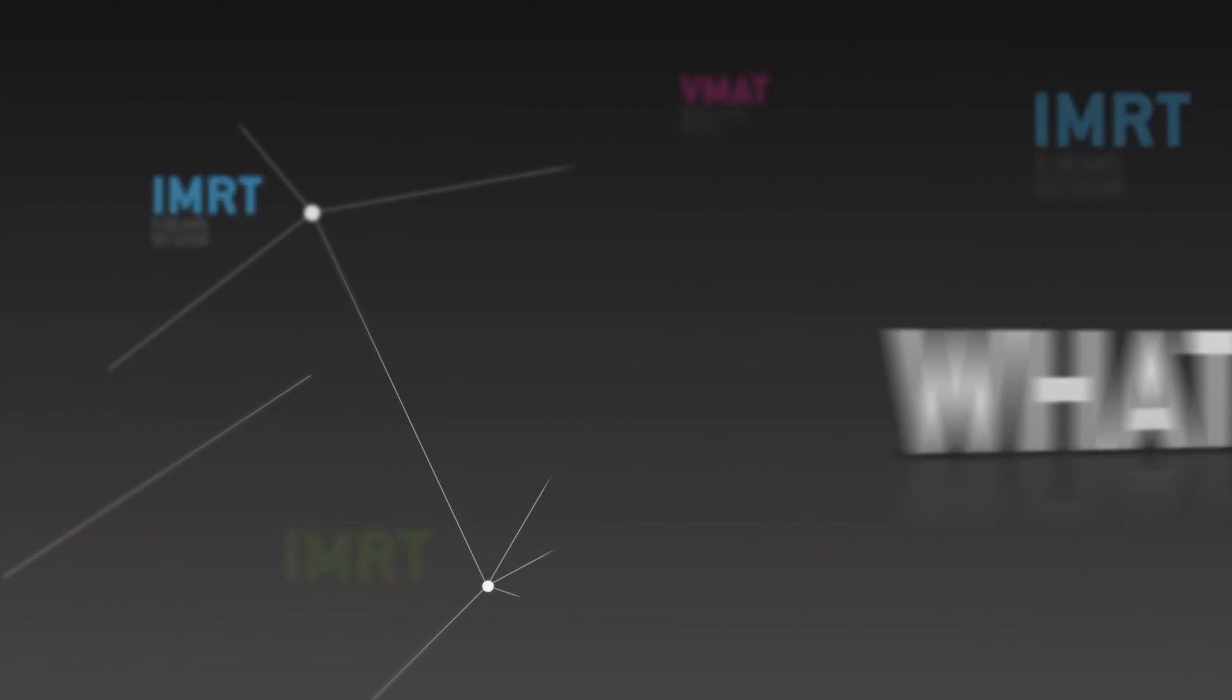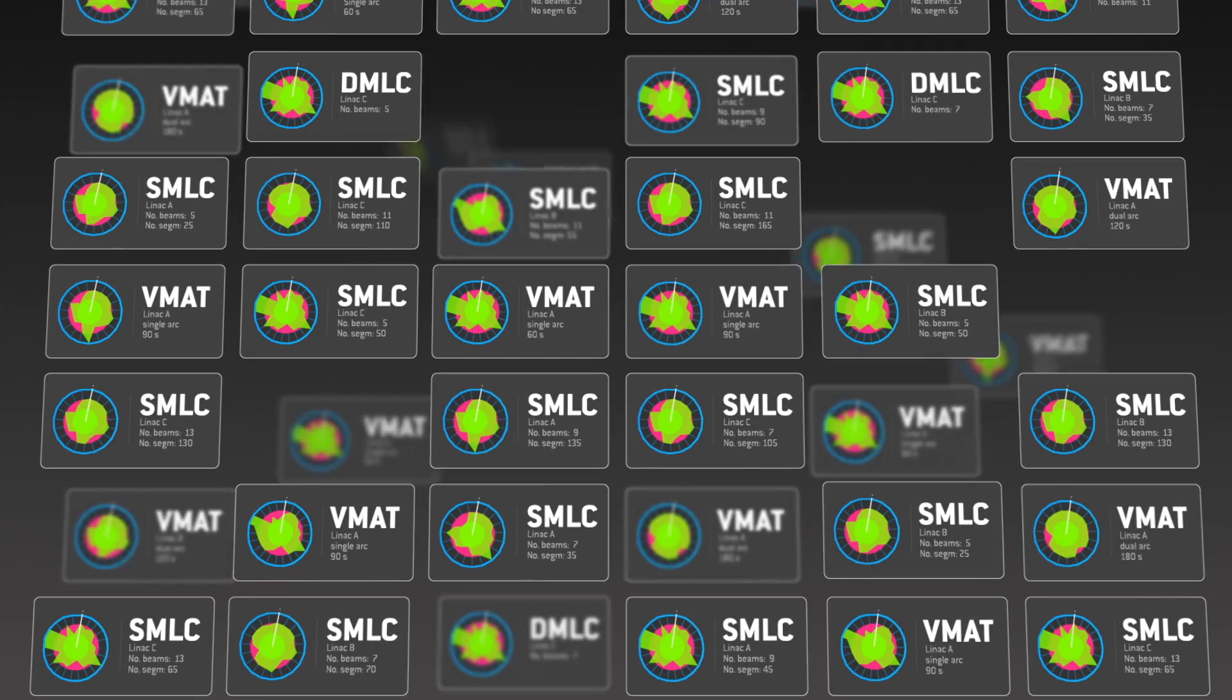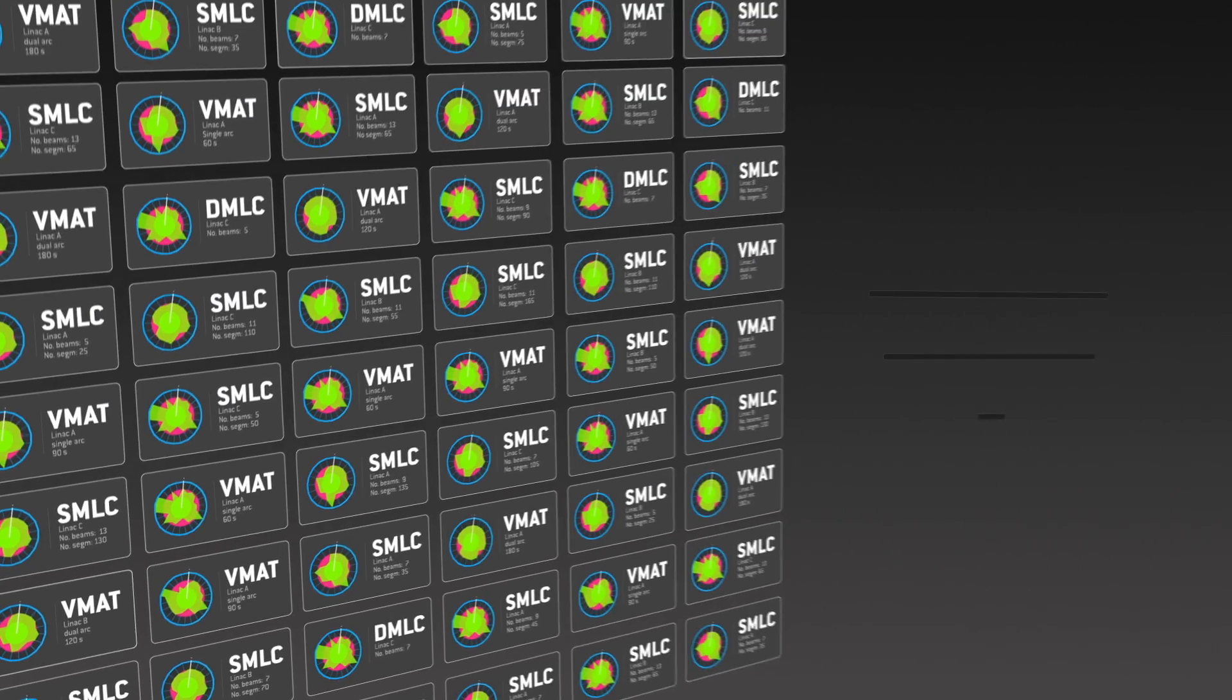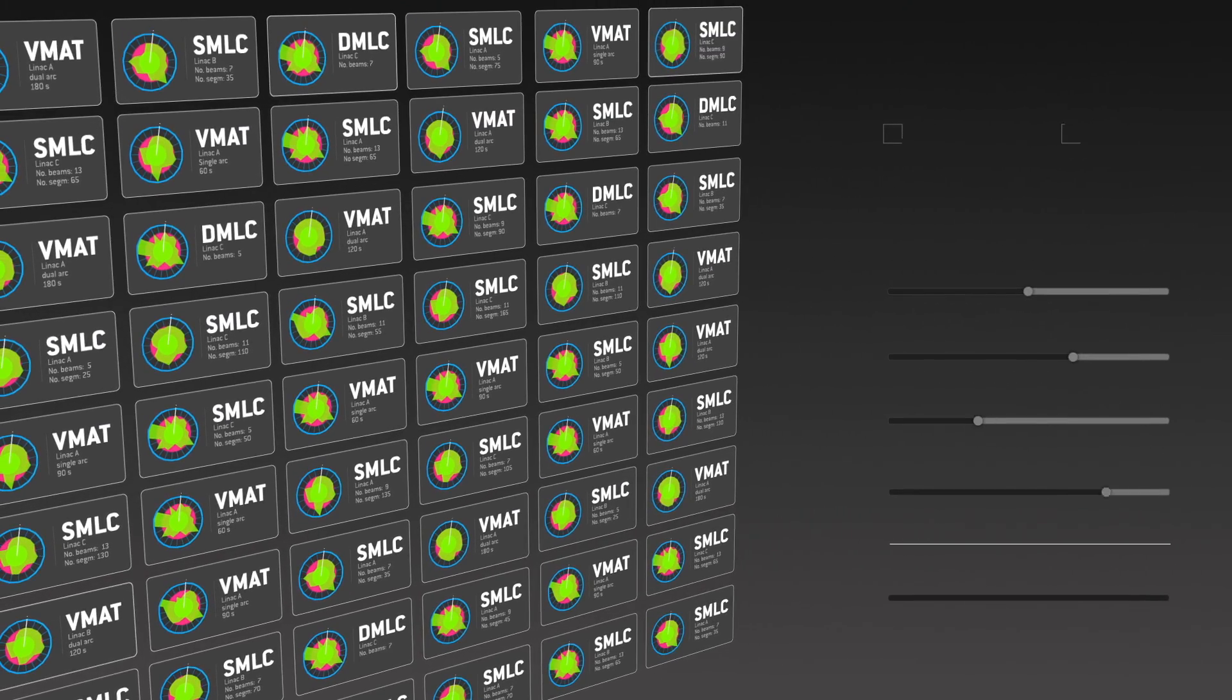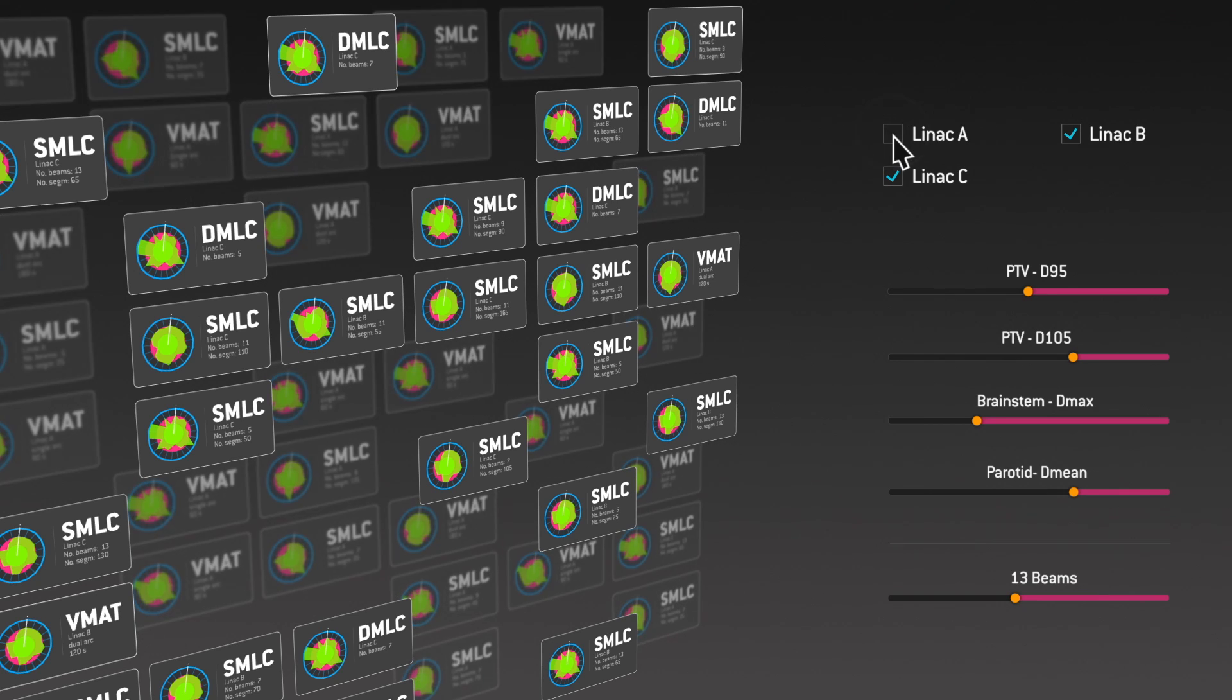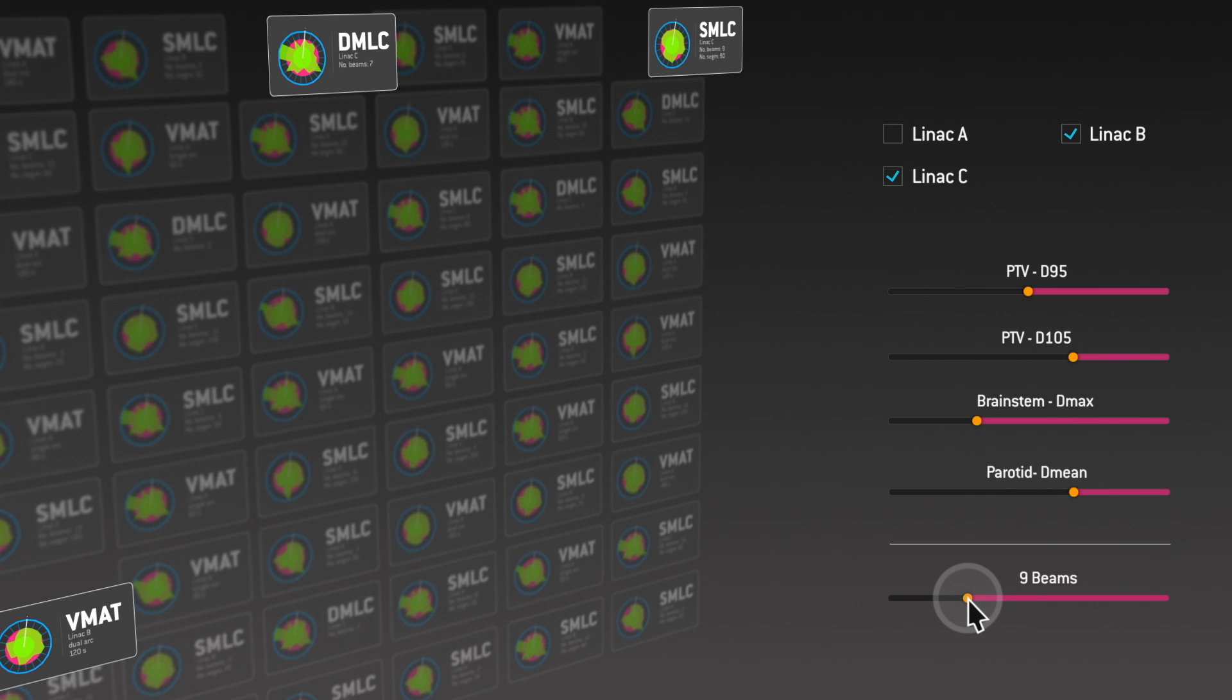This is Plan Explorer. It automatically generates a large number of plans for defined clinical goals and combinations of treatment techniques and machines. You can then filter the plans based on the fulfillment of clinical criteria and delivery efficiency considerations to find the most desired candidates.